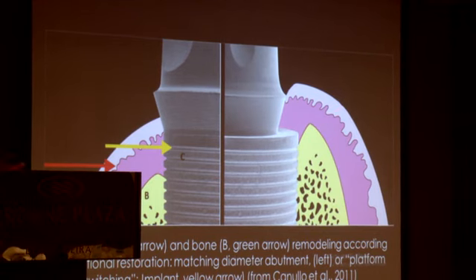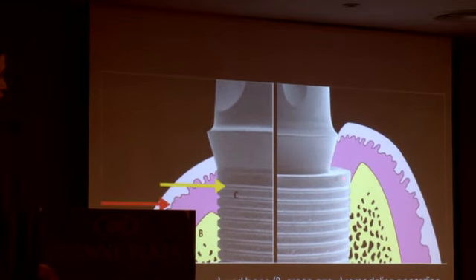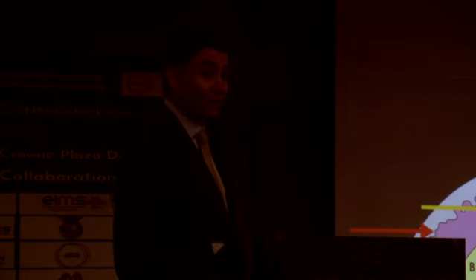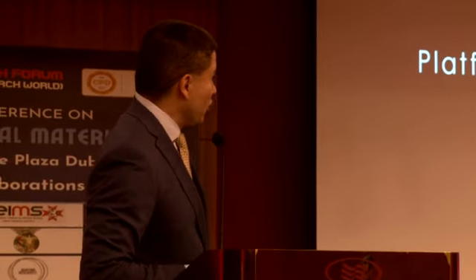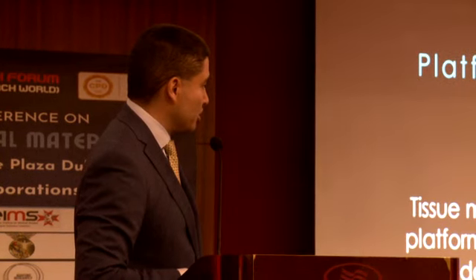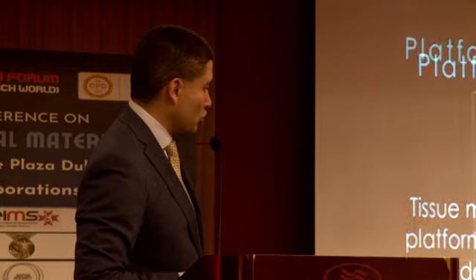So now there are some manufacturers in the market that have designed implants with this polished collar from here to here, and the rest is roughened, right? Perhaps that's a better implant. You still place it at bone level or submerge it below the bone level to get more tissue thickness, right? That's how you cheat the system, right? Now, obviously, if you have a slanted surface and you have invagination of the tissue here, that's going to help you to protect against the physiologic bone loss.